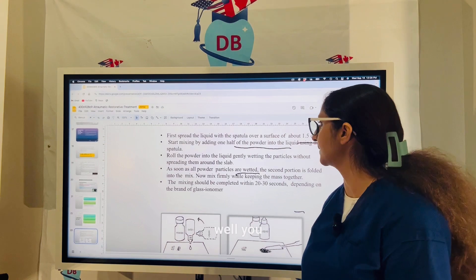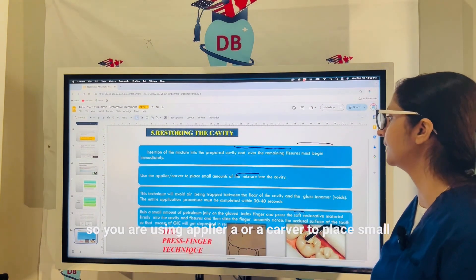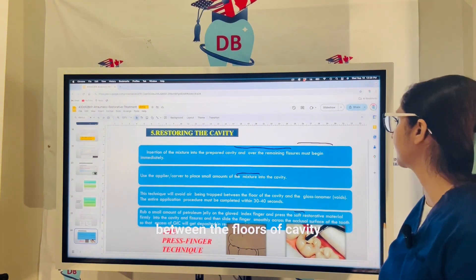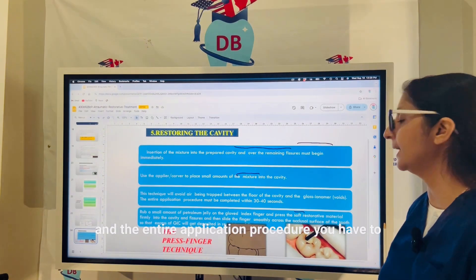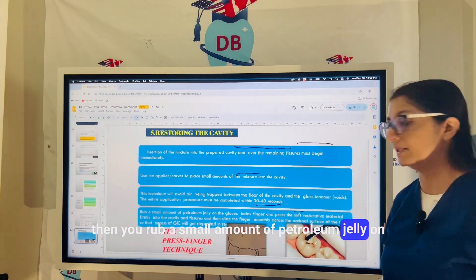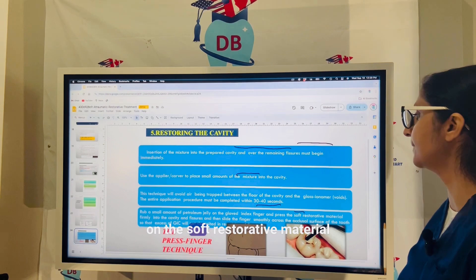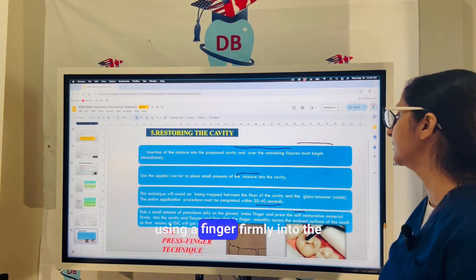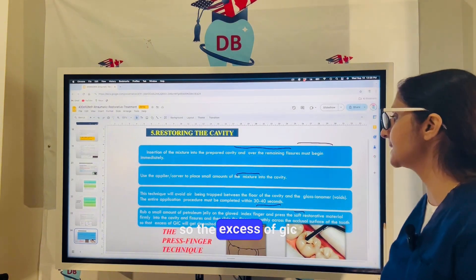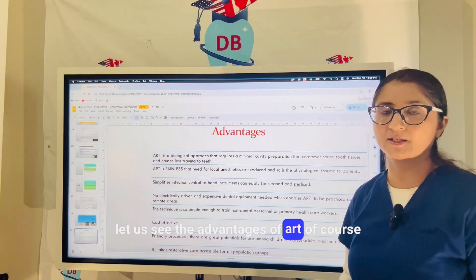Insert the mixture into the prepared cavity and over the remaining fissures immediately using the applier/carver. Place a small amount of the mixture into the cavity first to avoid air trapping between the floor of the cavity and the GIC, so that voids are not formed. The entire application procedure must be completed within 30 to 40 seconds. Then rub a small amount of petroleum jelly on your glove finger and apply the press finger technique — applying firm pressure on the soft restorative material and sliding the finger smoothly across the occlusal surface so the GIC is deposited into the remaining cavity.